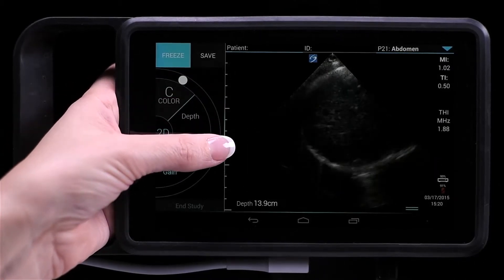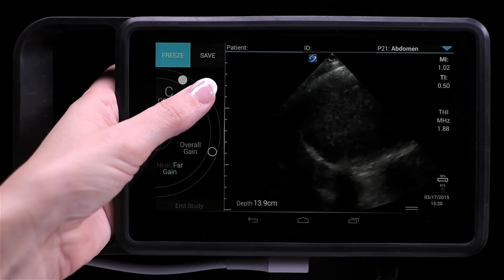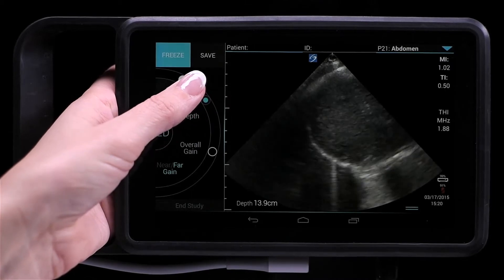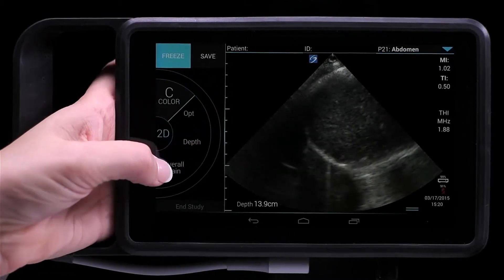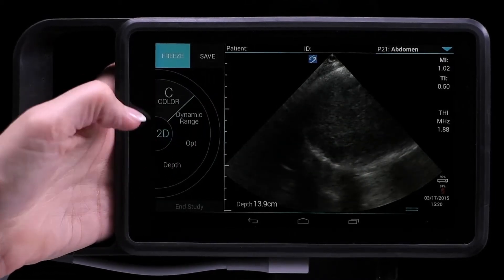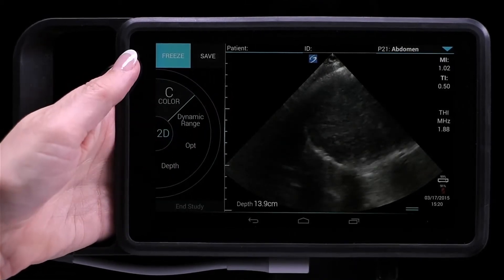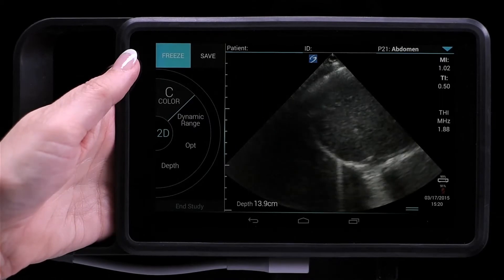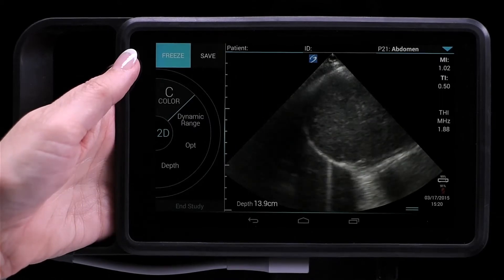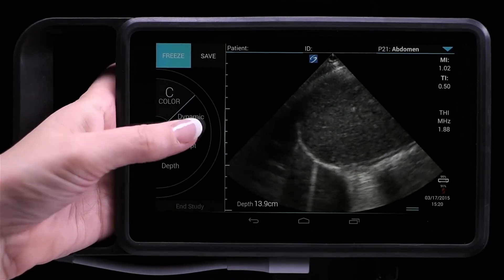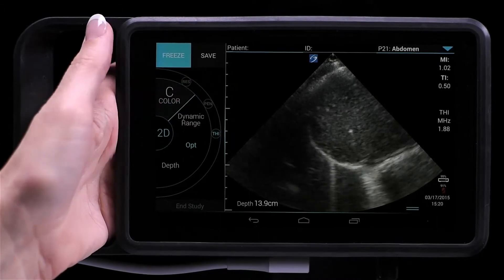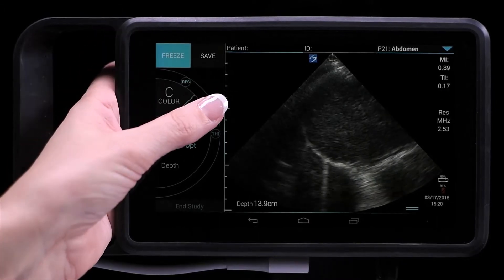To adjust your imaging frequencies, slide the control wheel to OPT, which stands for optimization. This allows you to change between RES, PEN, or THI.